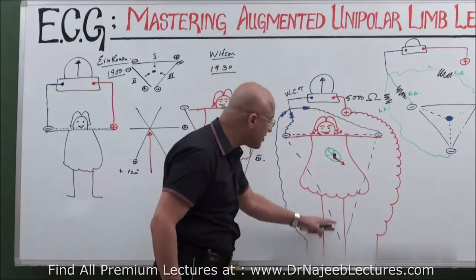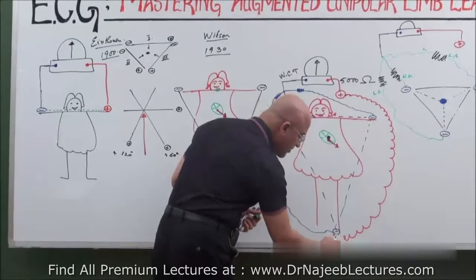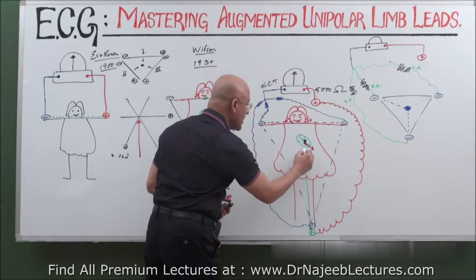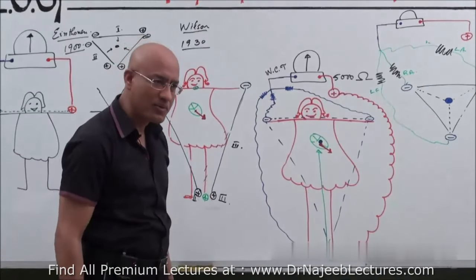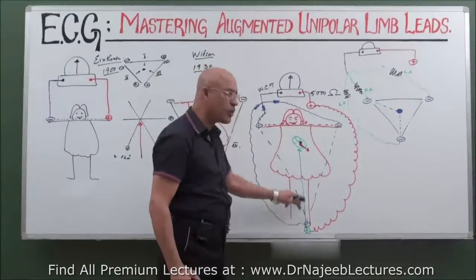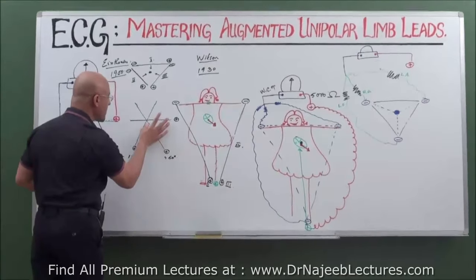So what will be the axis of this new unipolar lead? We have put the positive electrode here. It will be straight looking up, looking at the bottom of the heart, of course. It's getting a perfect 90 degree view. The most naughty lead I think we have. So in this way, what was Wilson able to achieve?